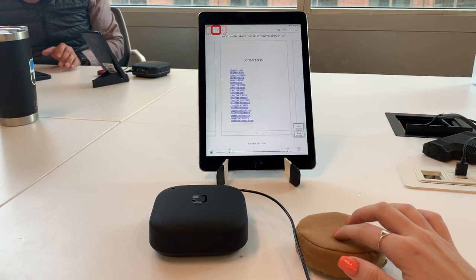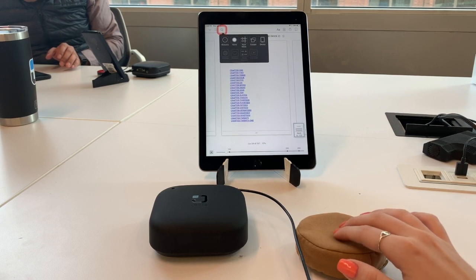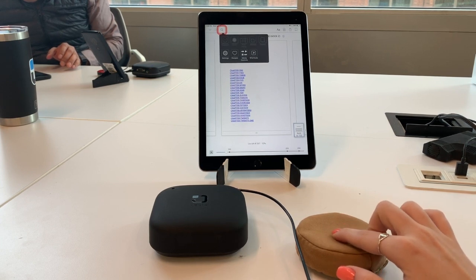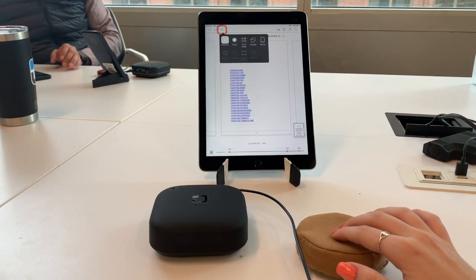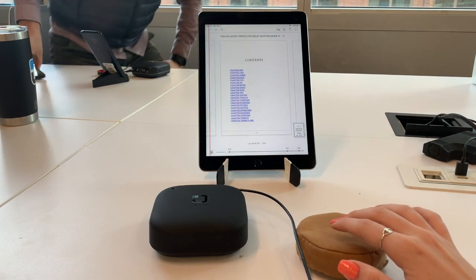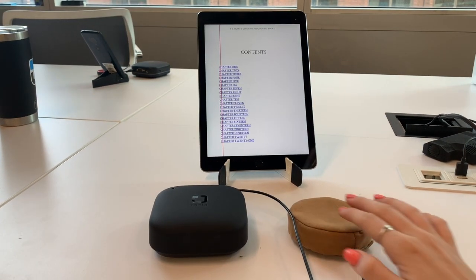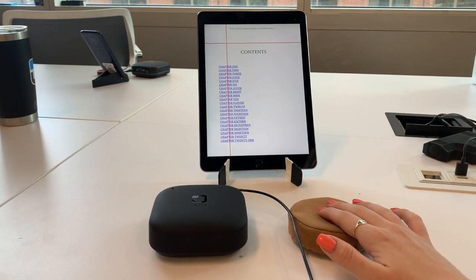To do this, go back to the top left corner, but this time select the third icon. On the first page of selections, you will see point mode. For the purpose of this video, we will be reading Chapter 2. Please align your scanning lines so that they create a target on the screen. This target will make this selection.